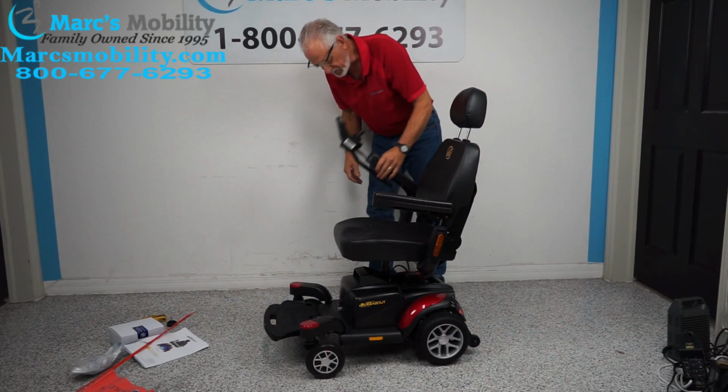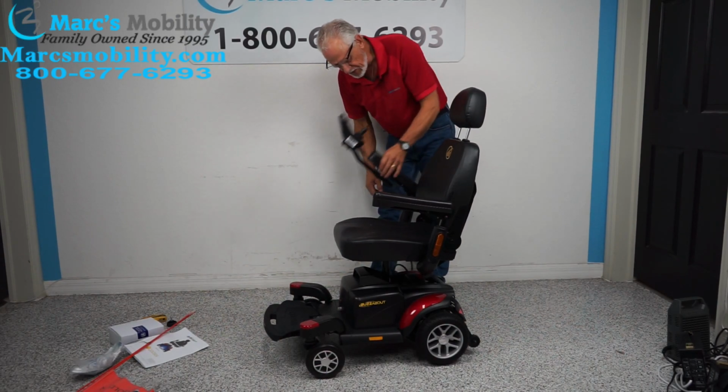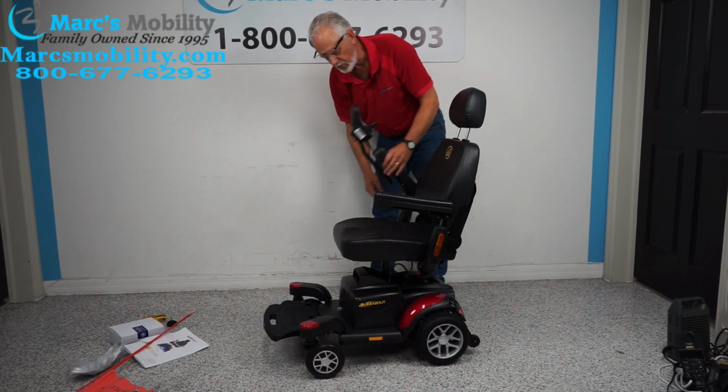Make sure your cable is attached to your arm so it doesn't get caught up in the hinge of the arm. You don't want to get the cable pinched.